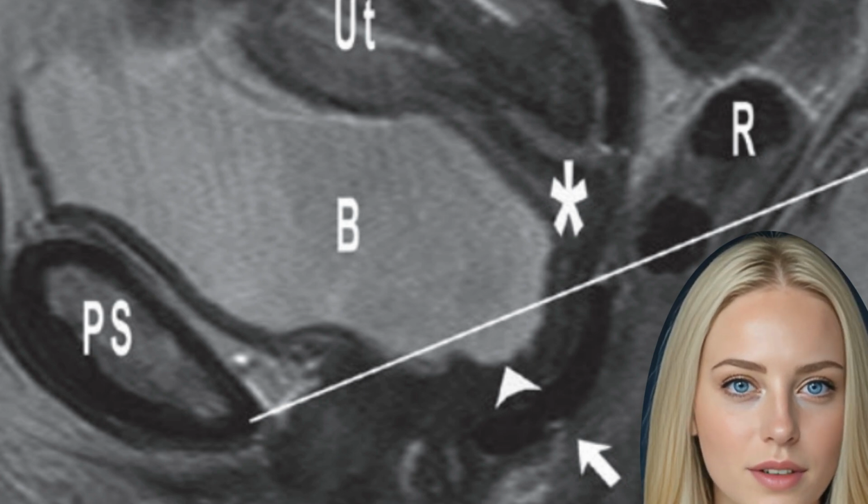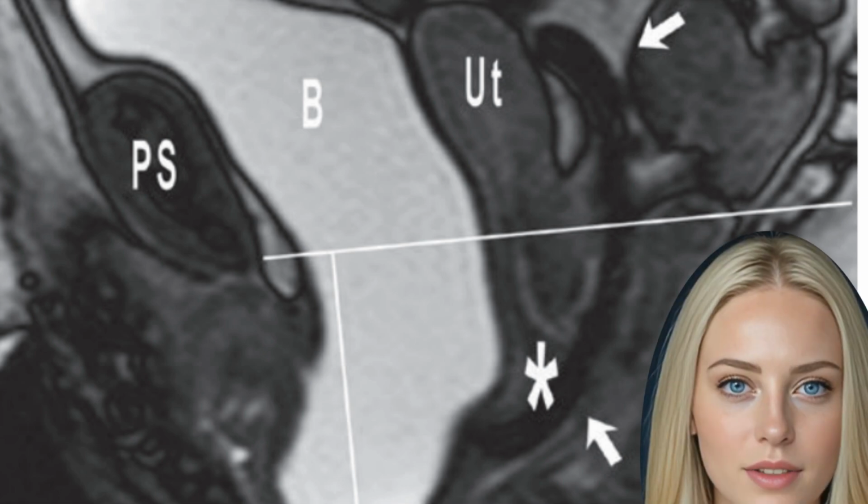Patient's preparation with vaginal and rectal filling with ultrasound gel helps to better identify the origin of the fistula. CT is mostly unable to detect small fistulas, which is why indication is usually not authorized.